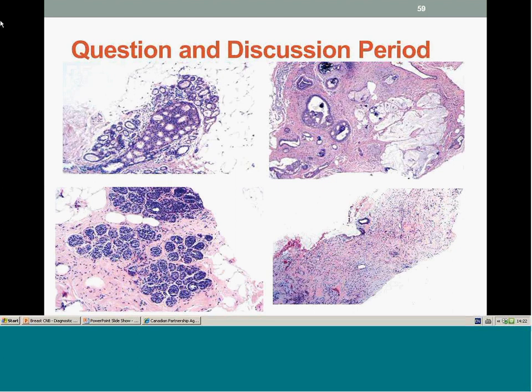All right. That is a submitted question. I did have one question, and that has to do with the role of immunohistochemistry for biopsy, distinguishing DCIS or ADH. How do you use immunohistochemistry and a particular cocktail that you use?